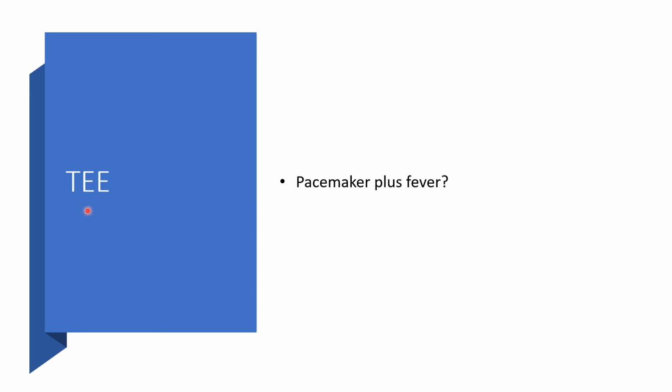You need to have TEE, but there is pacemaker and fever. Regardless of the outcome of TTE, we must have TEE done if anyone is on pacemaker and at the same time having persistent fever with or without murmur or bacteremia. We must have TEE done.